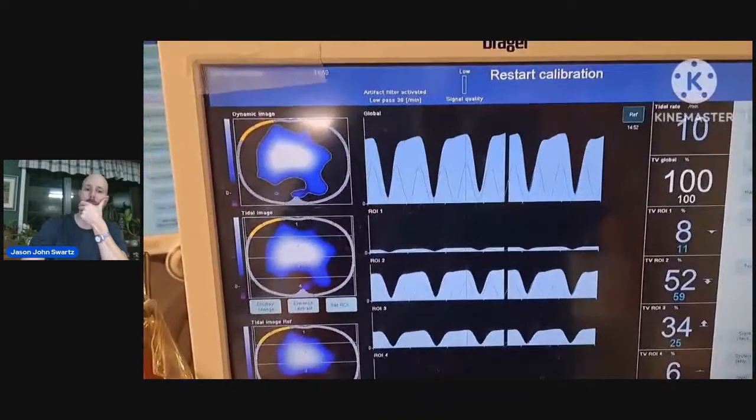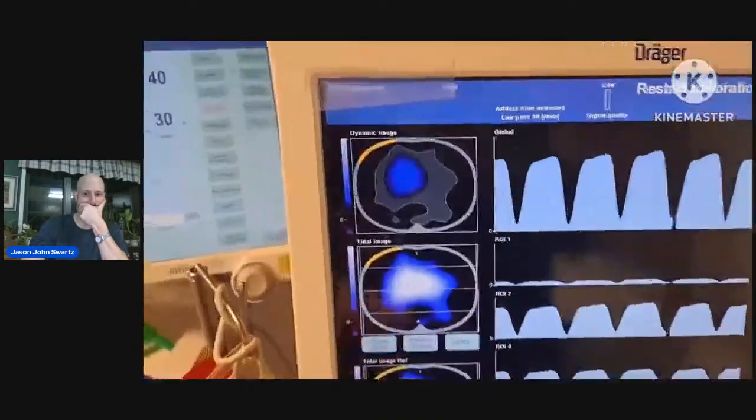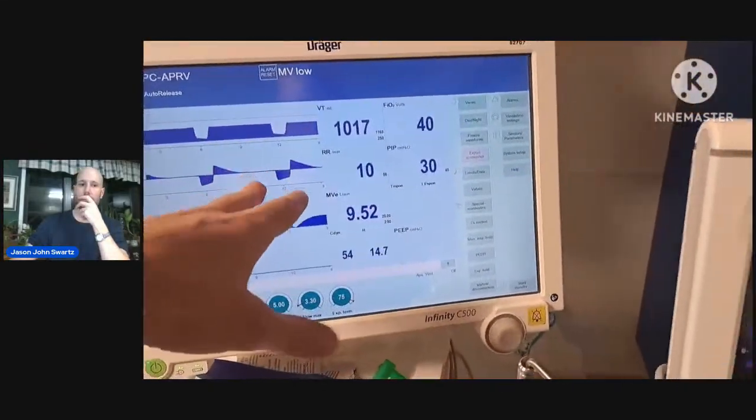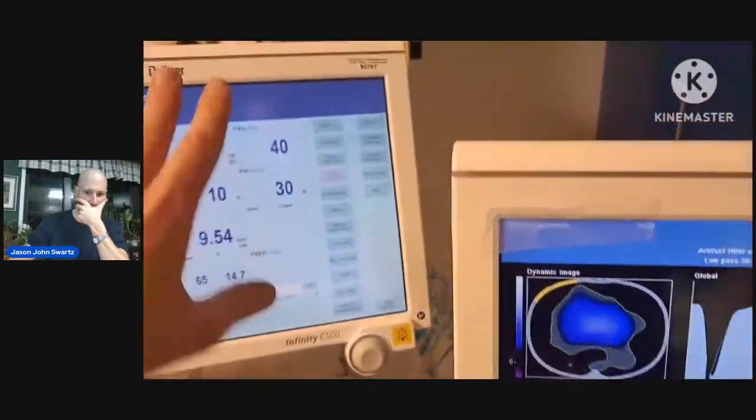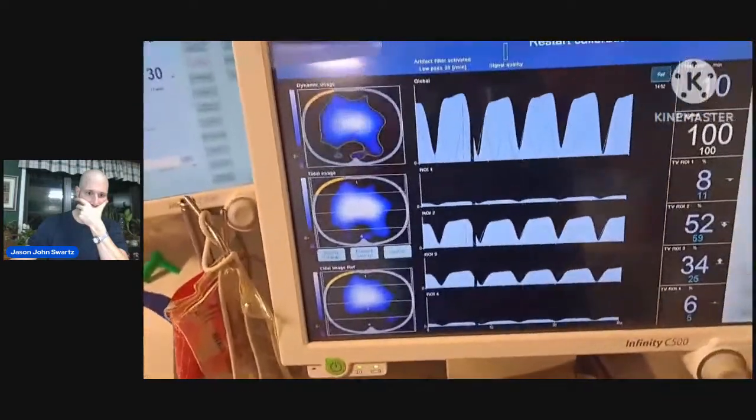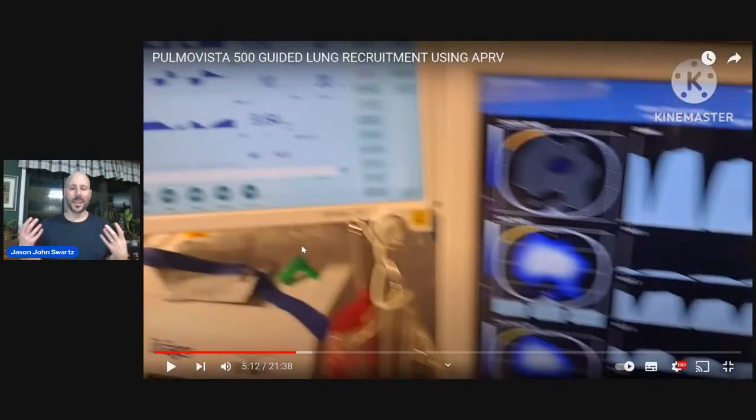This guy had complete dorsal atelectasis. So the tidal volumes may have been smaller, but when you have only half a lung to deal with, like 600 to 700, and now you might have a whole lung to deal with, higher volumes, then great. It's like we had a baby lung. We had a 700 tidal volume, and the guy only had half his lung. Now we pretty much opened up the lung completely, and now he has like 900. So yeah, 900 looks worse than 700, but at least the guy has recovered 50% of his lung.